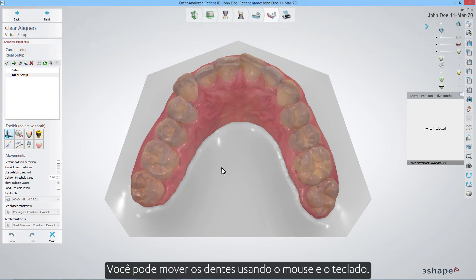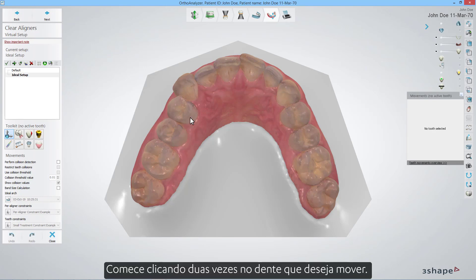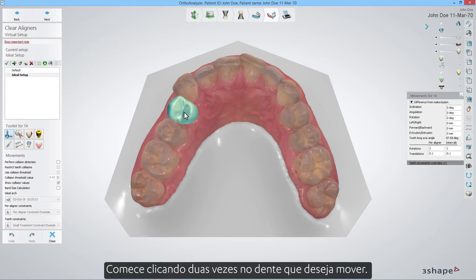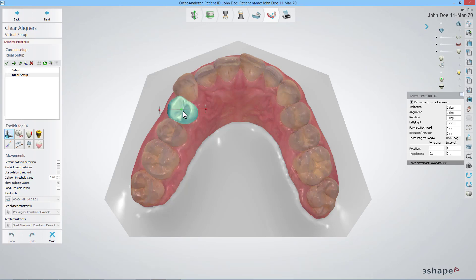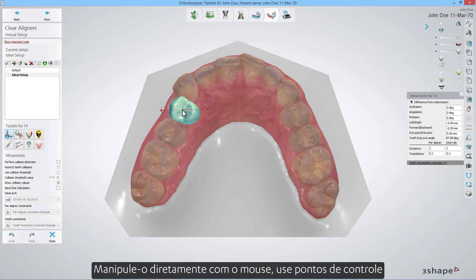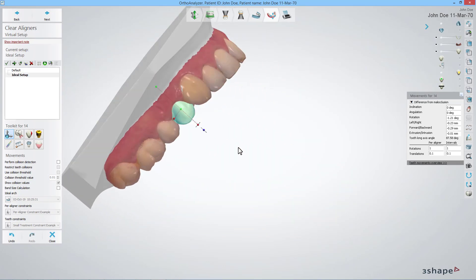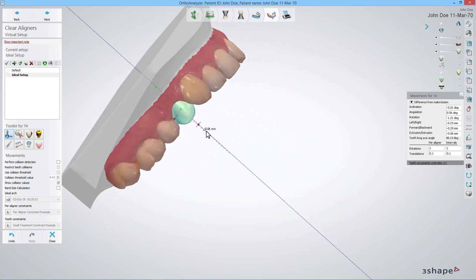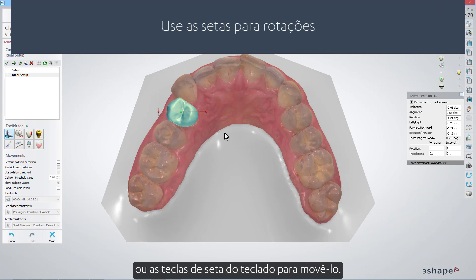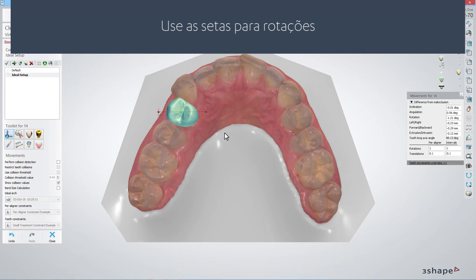You can move teeth using both mouse and keyboard. Start by double-clicking a tooth that you want to move. Either manipulate it directly with the mouse, use control points, or the arrow keys on your keyboard to move it.